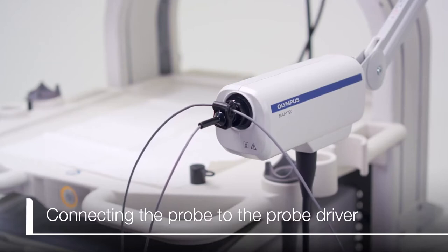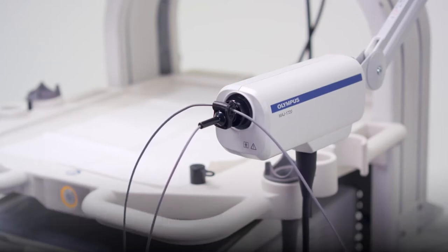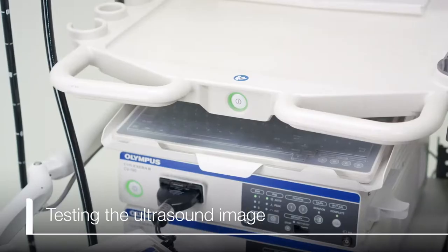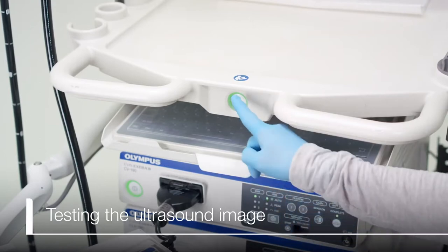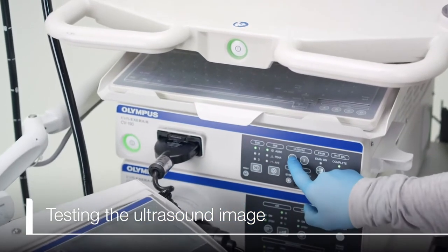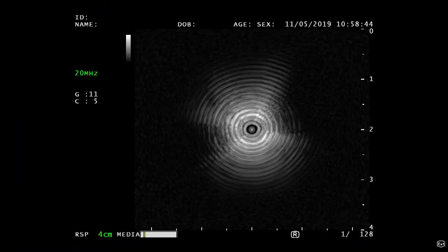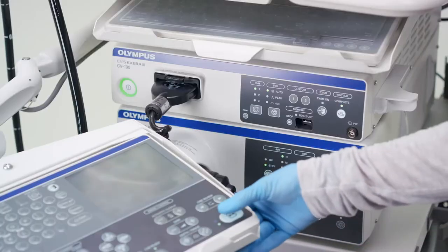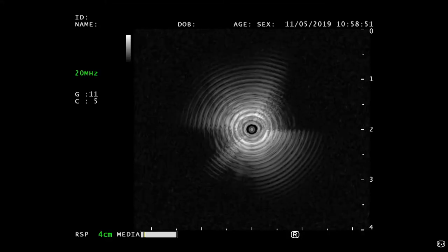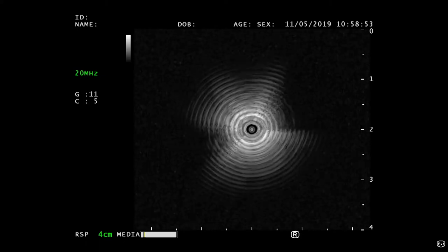Also, do not rotate the probe while inside the probe driver as it will damage the contact pin and possibly the probe driver. With the display monitor, ultrasound center, and tower on, press custom 1 on the CV190 to select the ultrasound image. Press the freeze button to unfreeze the ultrasound image. Confirm that the probe image is displayed on the monitor.